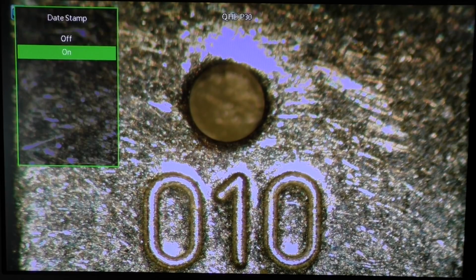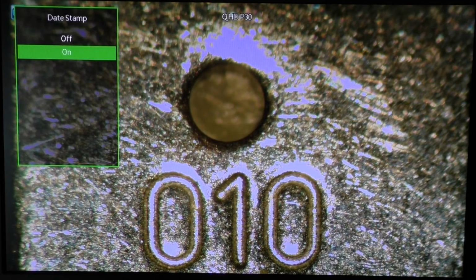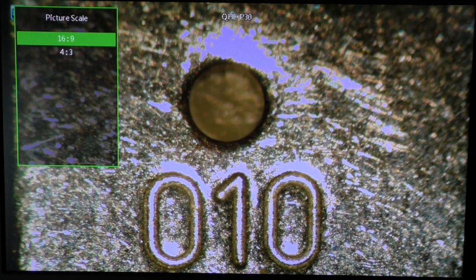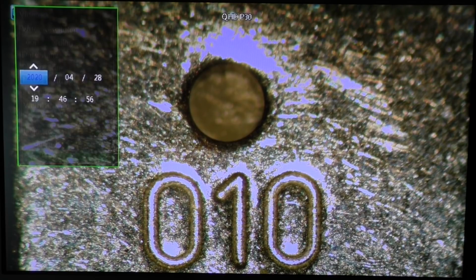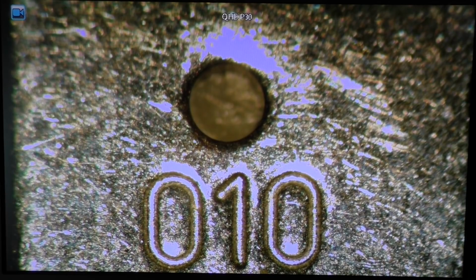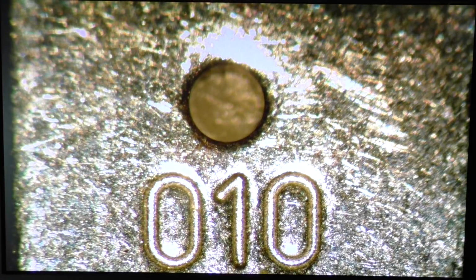Timestamp on or off. Where is the timestamp? I can't see it. Let's turn it off. I don't want that anyway. Picture scale, yes, that's about the same as on the still image. Mirror and contrast, yes. Exposure. And date and time, yes, that's all the same as on the still image menu. Okay, so I already told you when you press the mode, there is also a playback.